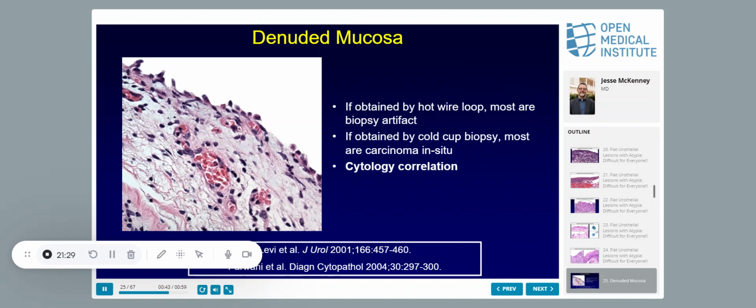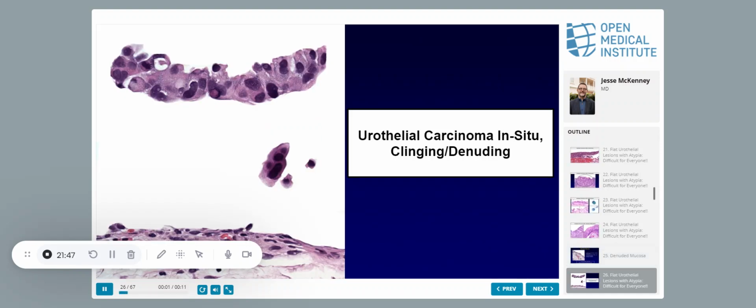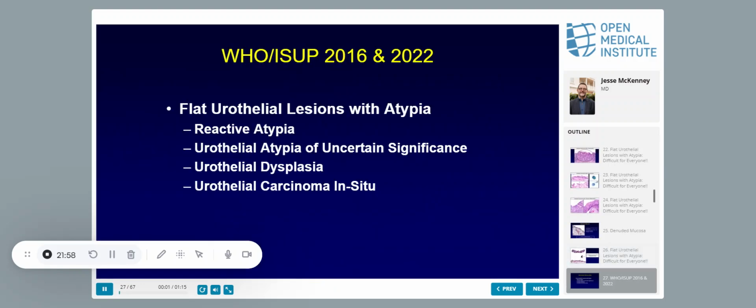These I would regard as, and again, I recognize if you haven't been looking at a lot of these, this is hard, but these I would regard as not CIS. I think these are just basal cells. They're not basal cells, but the basal layer of the urothelial cells. And again, the reason is when these denude, they're floating in the urine. So the urine cytology in a CIS is often floridly positive. Okay, any questions about CIS before we go to the other end of the spectrum?